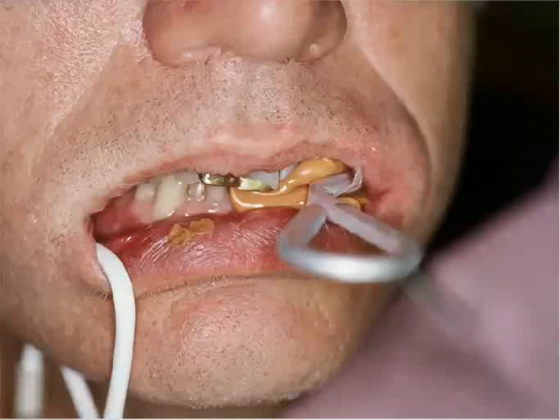The other thing, the patient has to remain in the proper centric occlusion for up to maybe 3 minutes. You have to think about where the saliva is, where the tongue is, the cheek muscles, because we can't evacuate the area very effectively. And then we have to think about what it is going to look like once we remove it. Have we really impressioned both sides adequately?